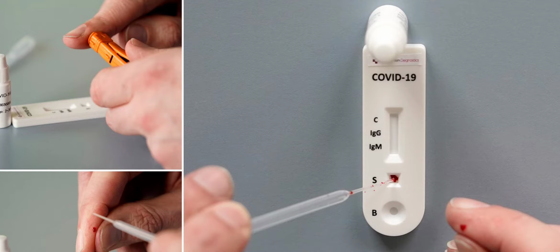If you have IgG antibody in your sample, then it is concluded that you have this infection and it is in a serious condition, or it is not the first time you are getting infected by this virus.